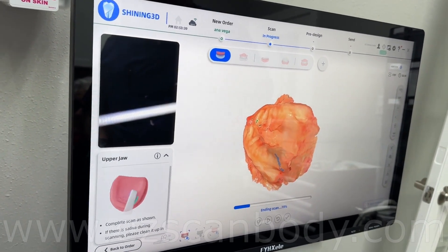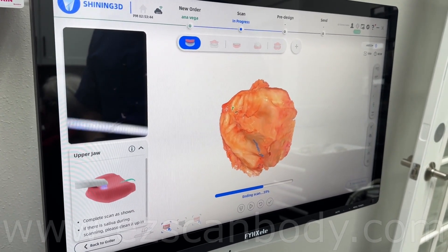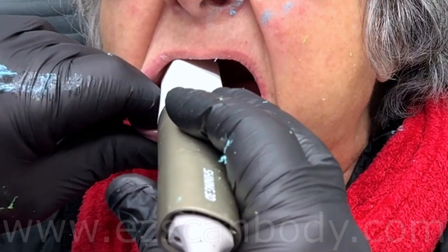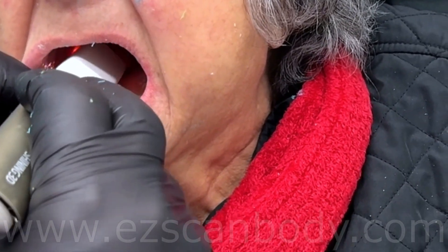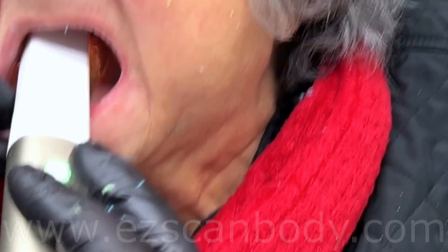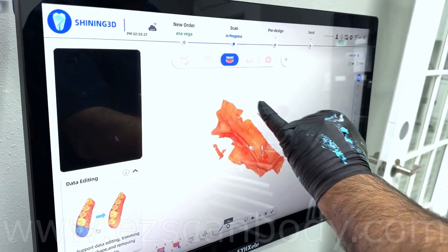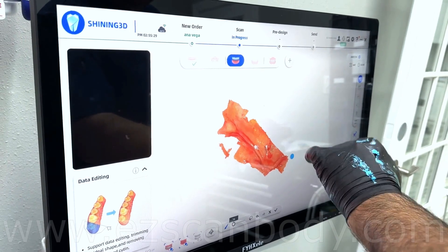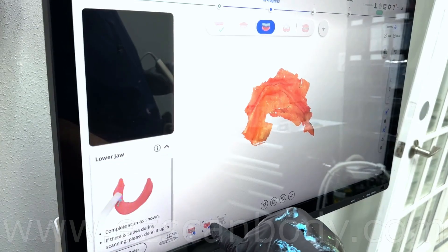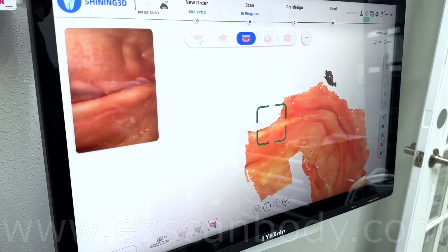If you are satisfied with the upper scan, the scanner gives the lower jaw scanning option. As you can see on the lower left side, there is a screen showing the protocol to scan the lower jaw. Make sure you scan as much gum as you can, especially the retromolar pads. You may need to hold the patient's tongue with a mouth mirror so it does not interfere with the scanning. Be careful — moving the scanner too fast can cause it to start a new area scan.